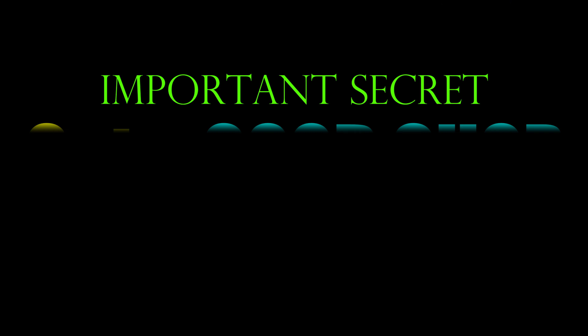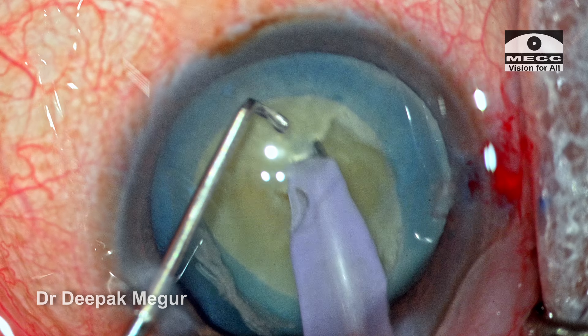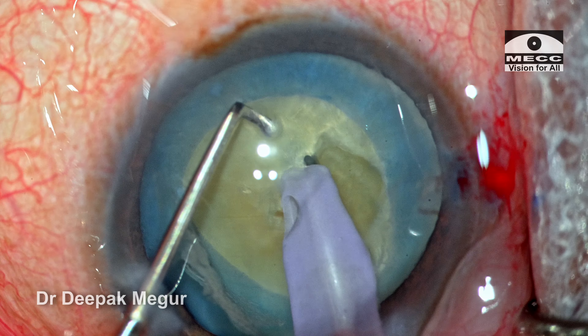The most important secret to get a good chop is to get a good hold. The secret to get a good hold is to ensure that the tip is buried deep down into the core of the nucleus. These are the details we are going to discuss in this video.